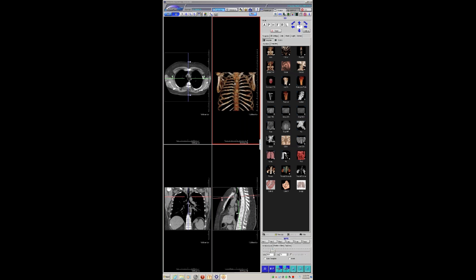Never. I don't know how you differentiate between them being on the pericardium versus the mediastinal pleural reflection. Yeah, I think it's because some of them were along the undersurface of the heart and looked more confined to the pericardium. I'll try and pull it up, but I wonder if it could have been pericardial calcification for another reason. I don't think I've seen. Again, I have an N of 3 or 4 cases of pericardial meso with any plaques anywhere or any pleural calcification anywhere, even though that's what they say should happen, at least.